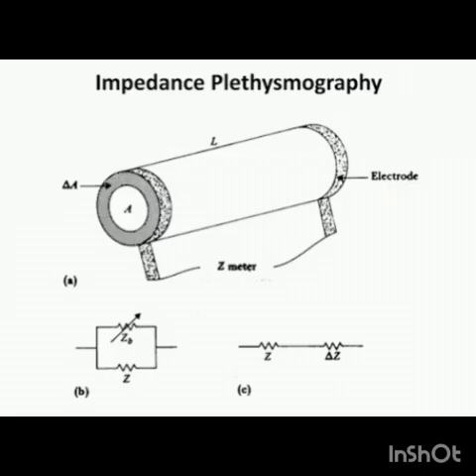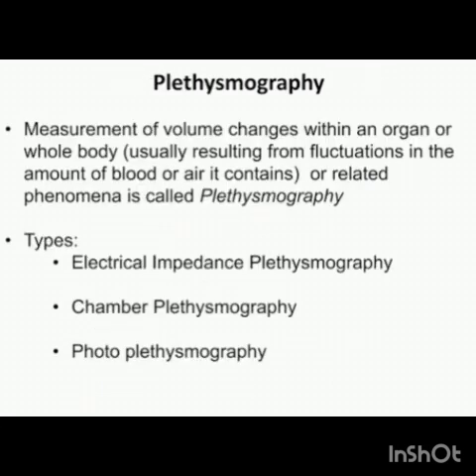The patient is asked to make an inspiratory effort. As the patient tries to inhale, the lungs expand, decreasing the pressure within the lungs and increasing lung volume. In turn, the pressure within the box increases, since it is a closed system, and the volume of the box is compared as the air accommodates to the new volume of the subject.